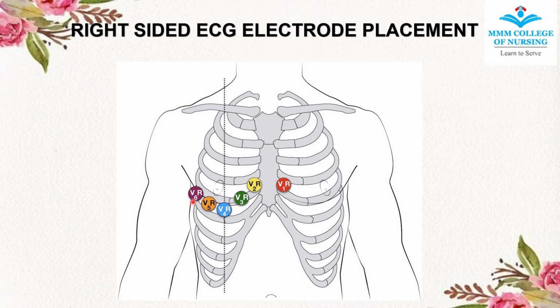And here, the right side ECG is also always asked for in case of a patient who is having inferior wall myocardial infarction, because inferior wall MI patients often present with right ventricular myocardial infarction.